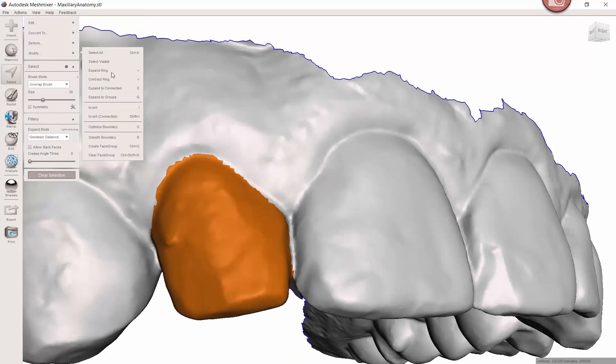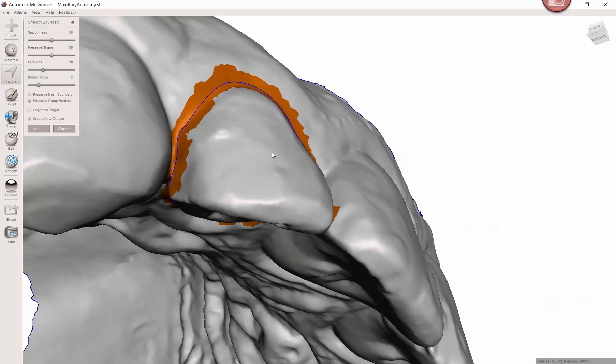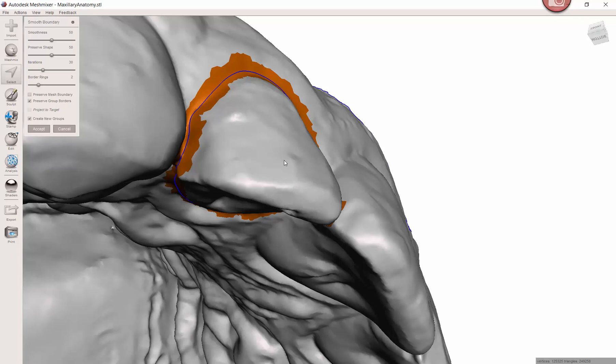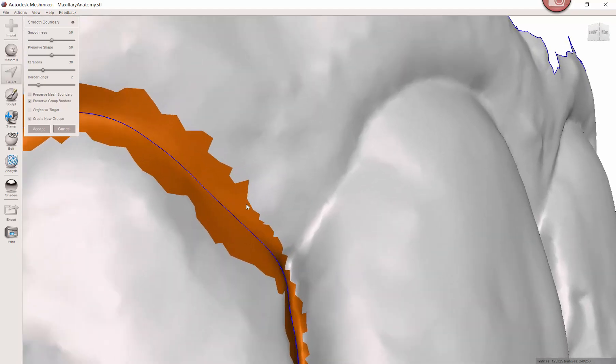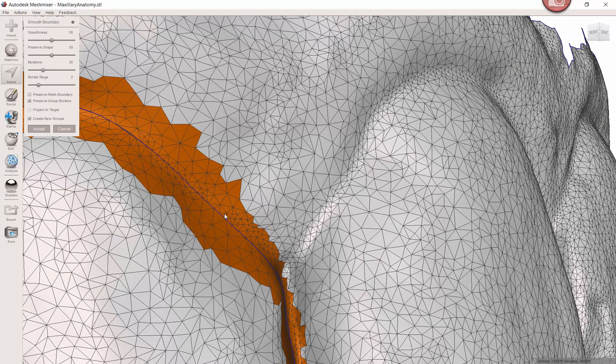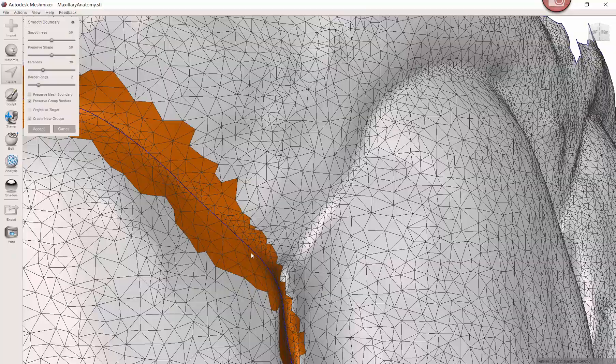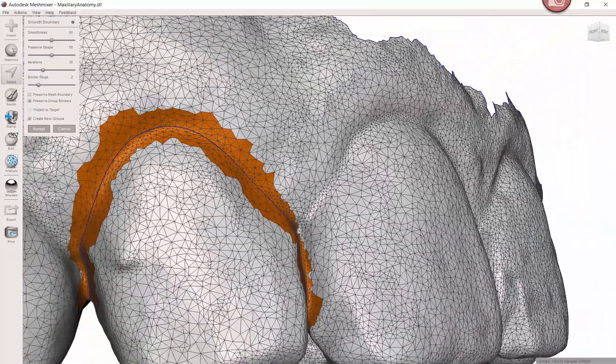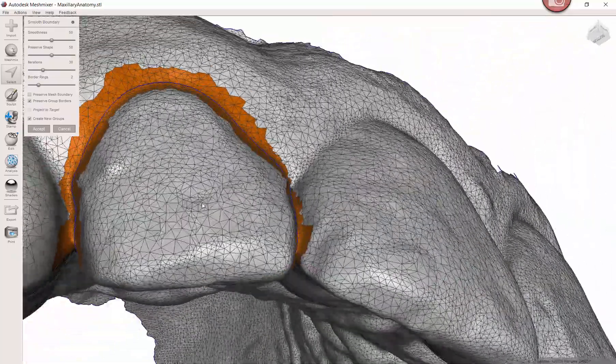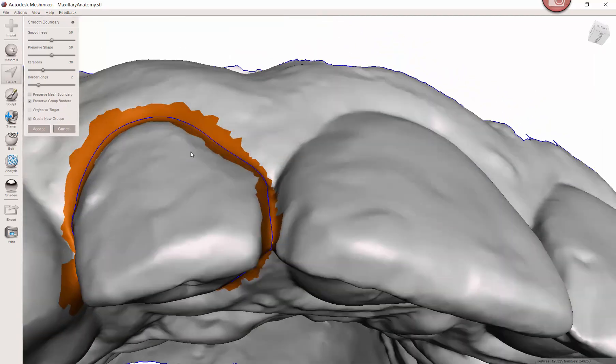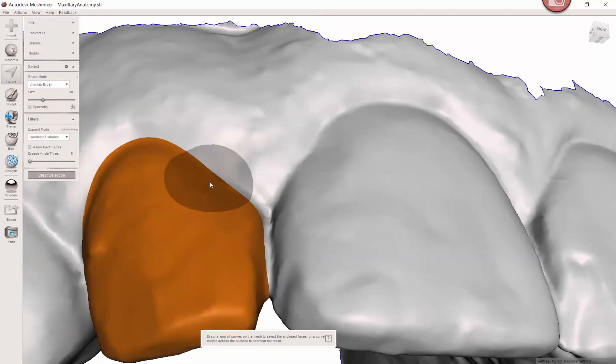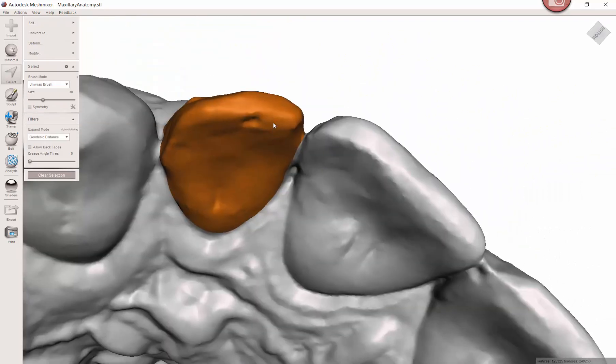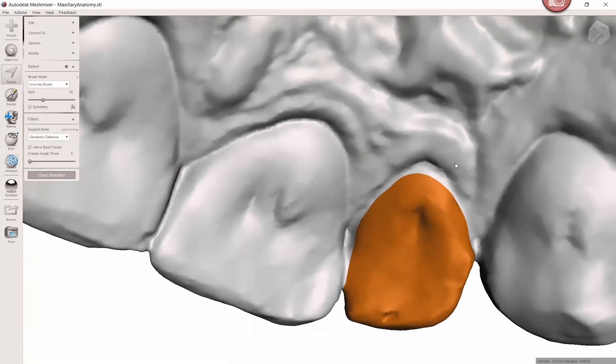Now it's going to give me a nice smooth line. If I press the W button, you can see that it's actually retrying and remeshing this area so it can get a nice smooth transition. That's not necessary to click on, I'm just showing that for demonstration purposes. If I click enter, now I've got this nicely smoothed out edge.